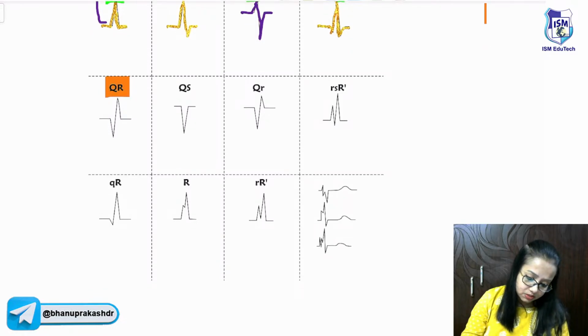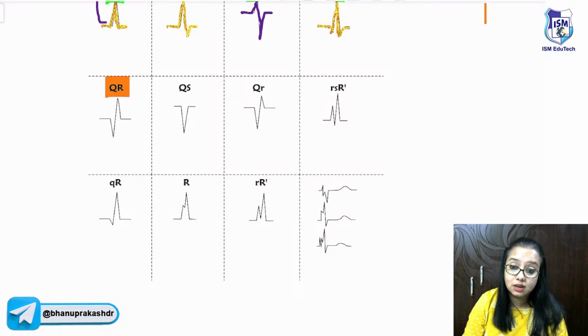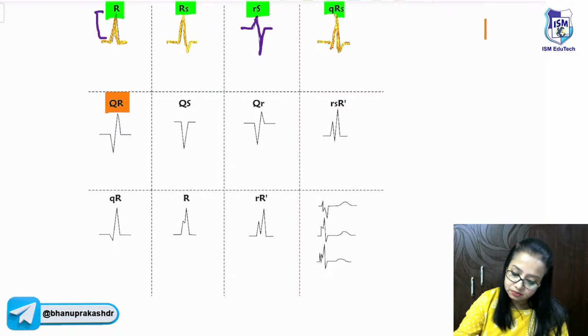See the criteria of someone called Tom Cruise. It would be better if you write your real name. The main criteria to call capital uppercase and lowercase is just as I am explaining: to see how big the amplitude of it is compared to the other waves, compared to the Q or the S that is present. By your eyes you can see and understand whether the R is bigger or smaller than the S wave or the Q wave.